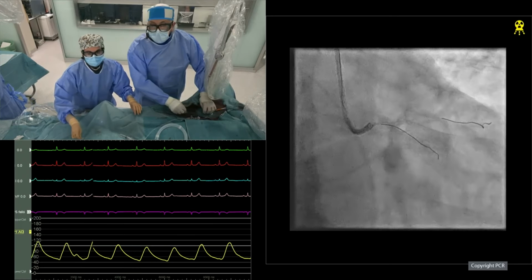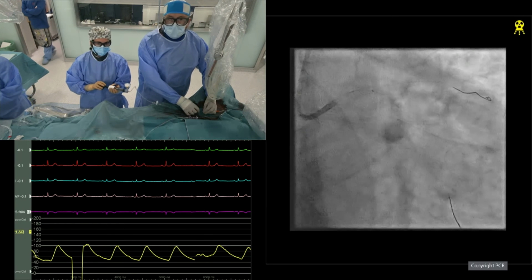They are very skilled operators. I'm sure they would achieve that. Most probably it will stay open. It will just be a bit more pinched. And then you should accept it pinched if it's TIMI 3 flow, because it's a trifurcation. You can't have a perfect result here.